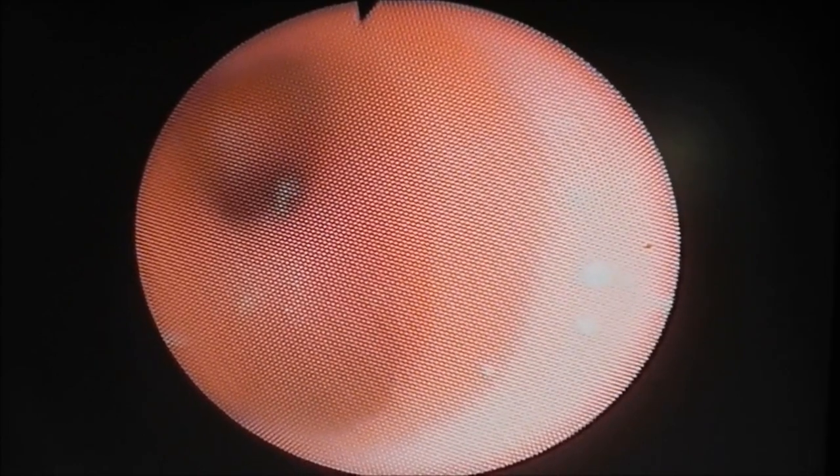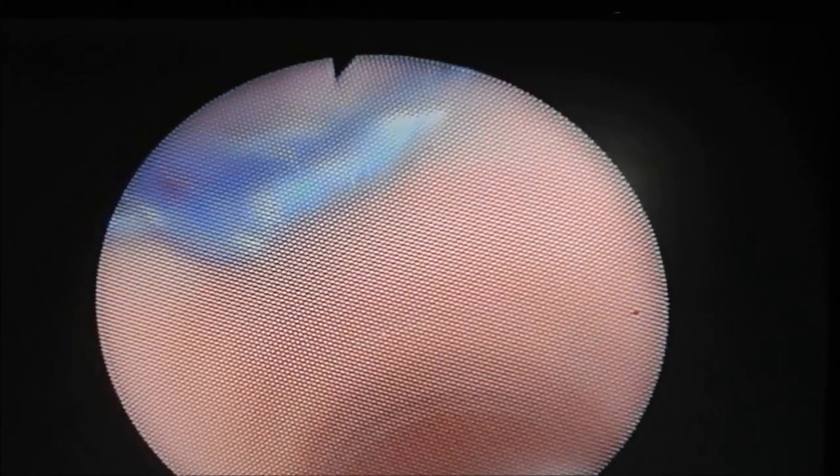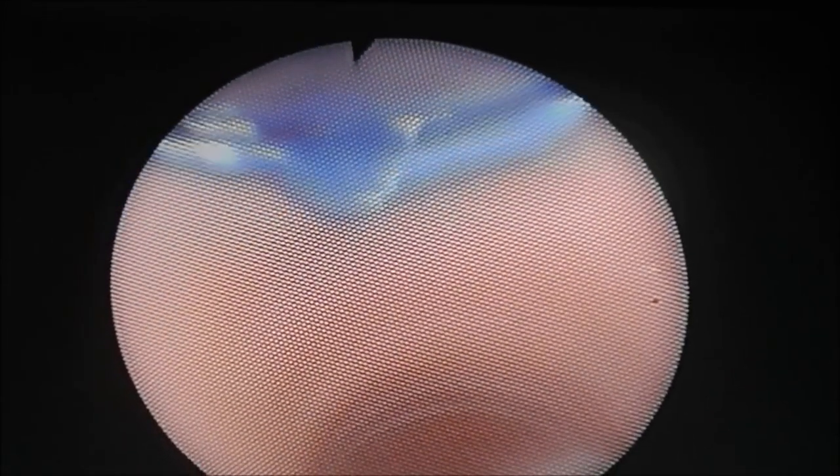Once the tube is advanced, I'm going to back out of the bronchial lumen and go down the tracheal lumen. Going down the tracheal lumen, I will see that the bronchial cuff is off to the left, and that it is not herniating over the carina.